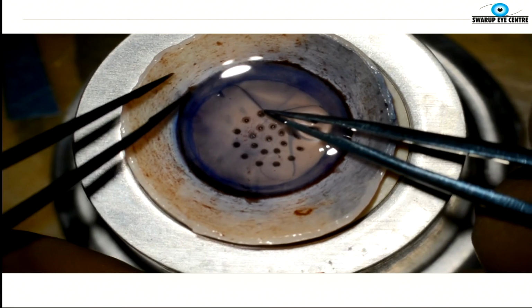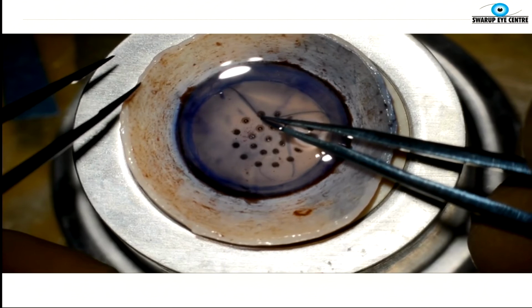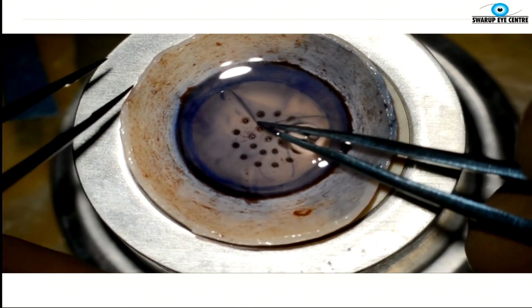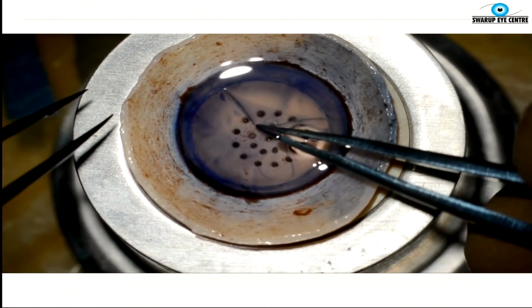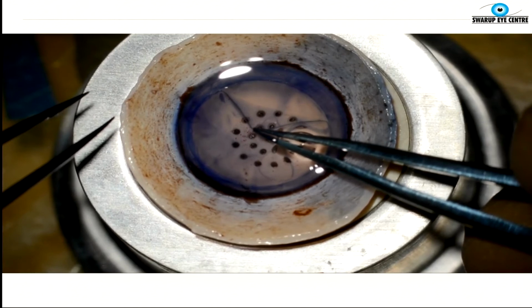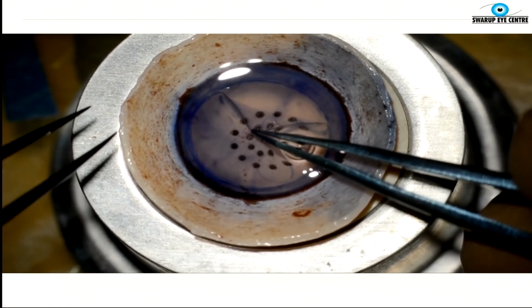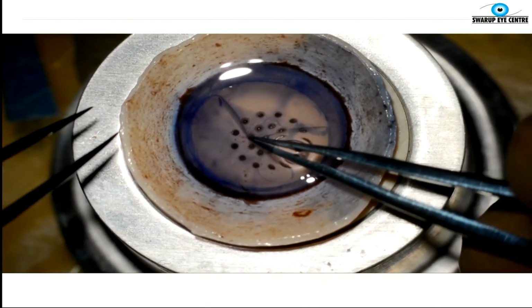And basically you can use 1 or 2 hands, and you have to strip slowly and keep an eye on this line. This should always be straight. If at some point that line is getting kinked, that means there is an adhesion between the Descemet membrane and the stroma, and it's at that point that it can tear. So if you ever see an adhesion, try to go around it, or maybe go from another area and come to that area in the end.